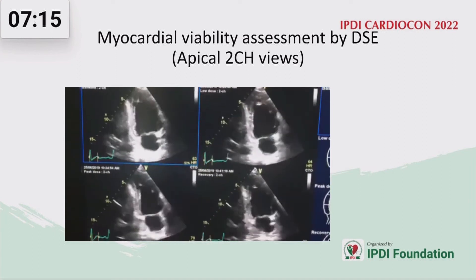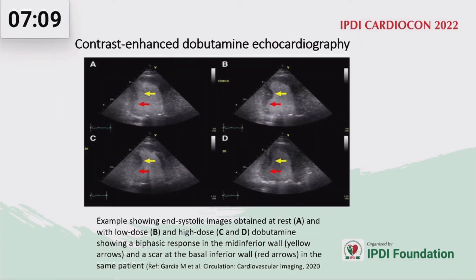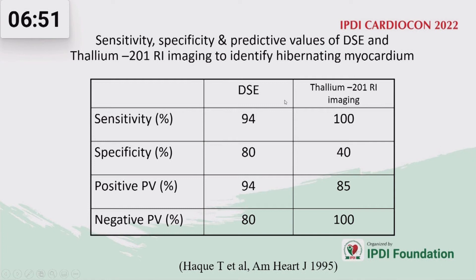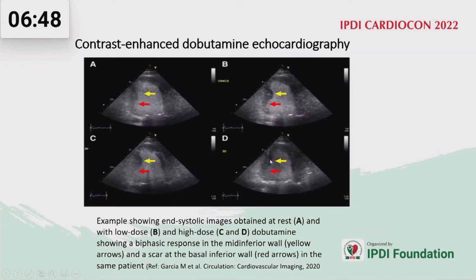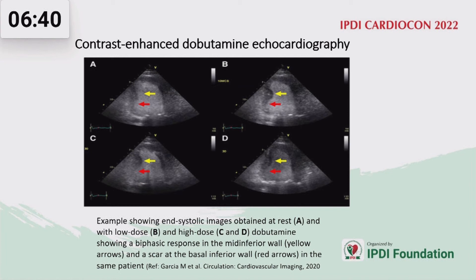This patient underwent CABG with improved outcome after revascularization. An example of contrast-enhanced dobutamine echocardiography is shown — apical two-chamber view at baseline, low dose, and gradually high dose. The mid-inferior segment showed increased contractility at low dose, but with increasing dose there was deterioration — a biphasic response. The basal-inferior segment showed no change in systolic thickening, indicating scar or non-viable myocardium.